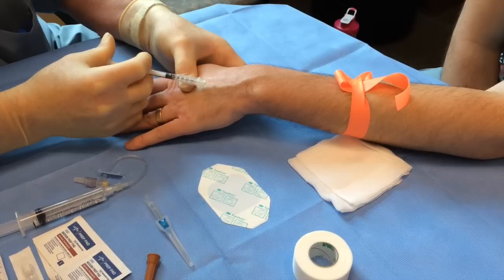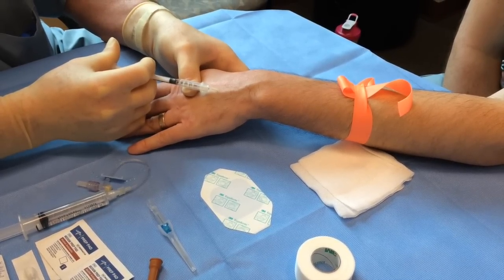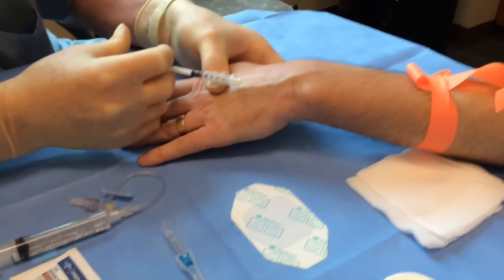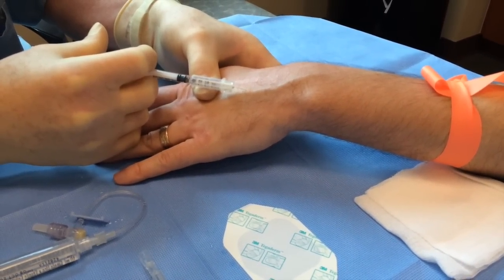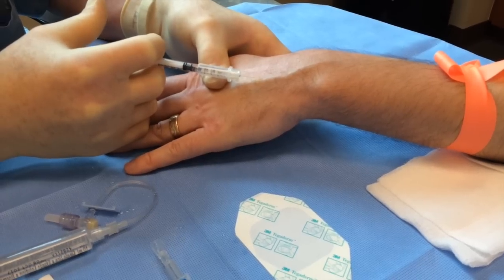You raise a wheal — it should be a wheal that you see, and it will appear as a mosquito bite or a bee sting. It turns the skin white. Just very slow, gentle pressure and you won't hurt your patient. That's about 0.2 to 0.3 cc's. I'm not rushing. I take that out.